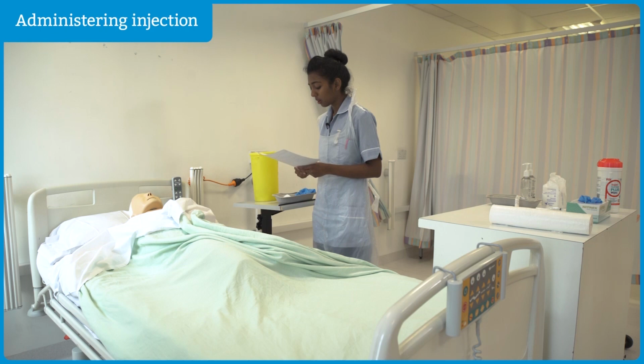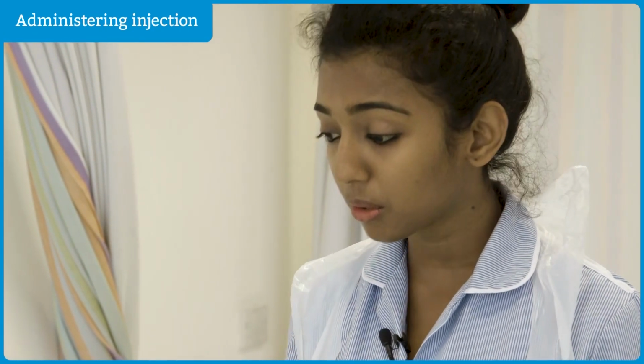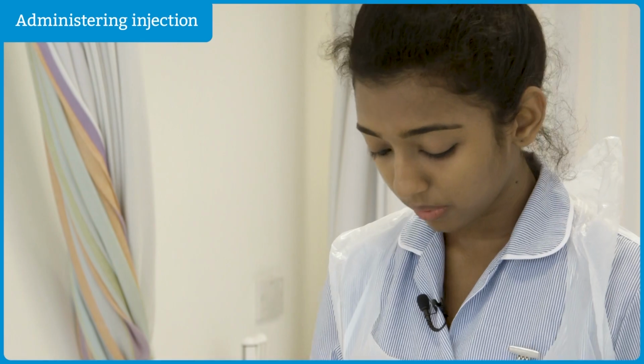So I'm going to give you the hydroxycobalamin injection, which is 1 ml. All right? Yeah, that'll be fine. So Anne, I'll be giving you the injection now. I'll be asking you to take deep breaths before giving the injection, and I'll be cleaning your area of injection with the alcohol swab. Is that all right? Yeah, that's fine. Clean the injection area for 30 seconds and allow to dry.